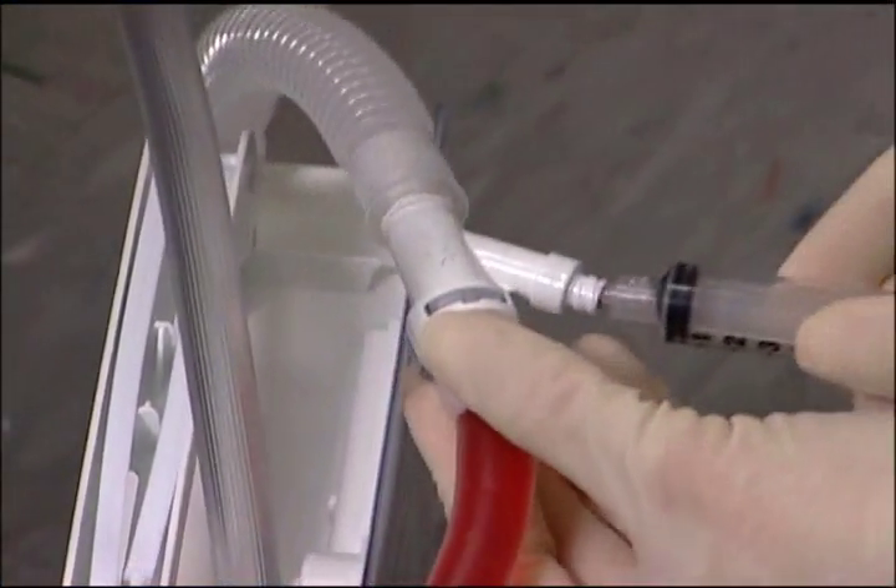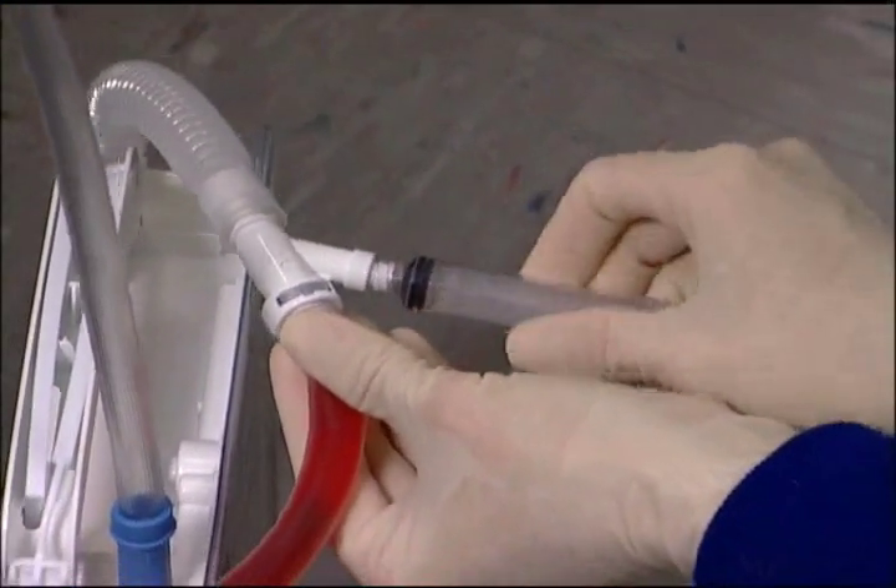On selected models, samples can be taken directly from the needle-less lure lock sampling port located on the patient tube connector.